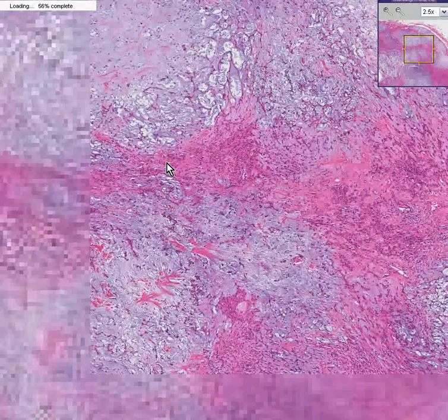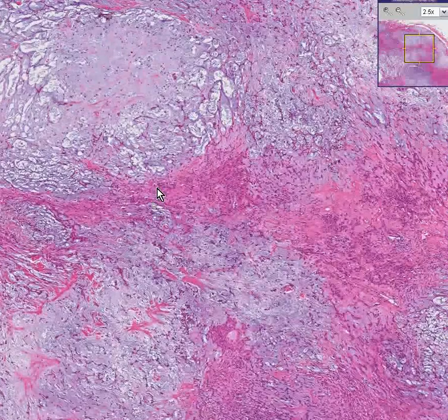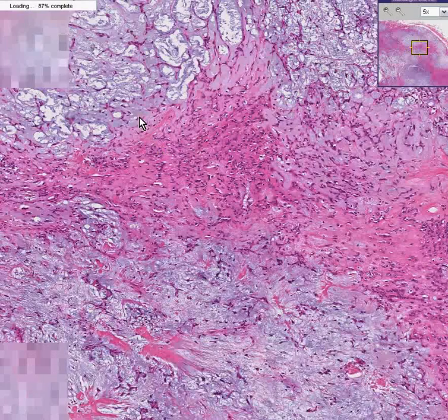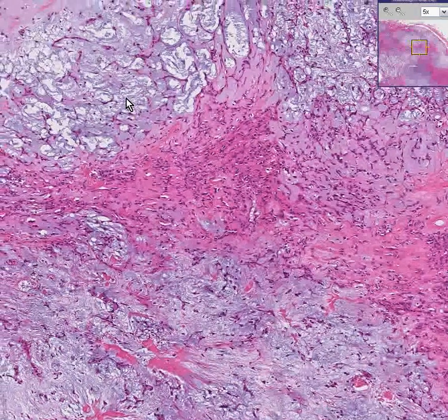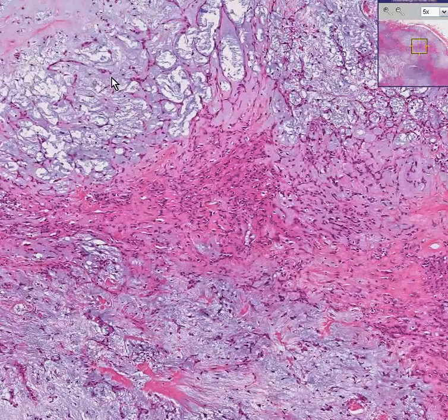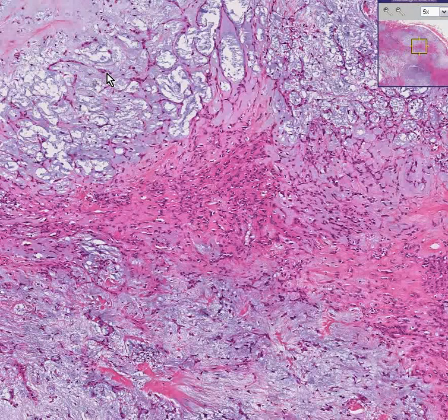Let's show you right now why this is called mixed or pleomorphic. Here is the cartilaginous component, and these little epithelial streaks in between are the glandular component. That makes it mixed. That makes it pleomorphic.